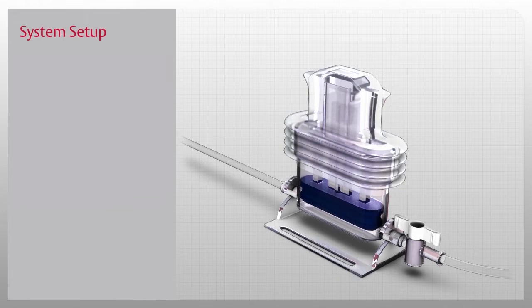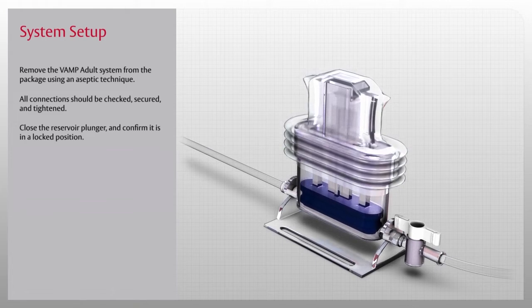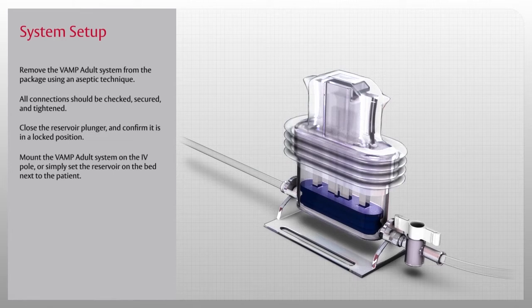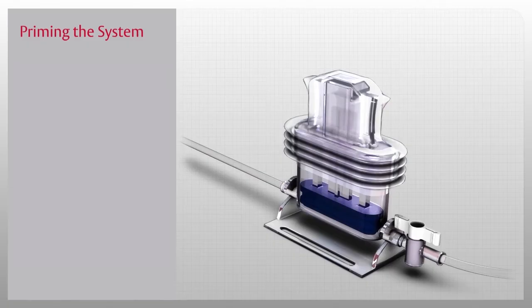Now that you've been introduced to the VAMP Adult System, let's start the in-service by setting it up. Remove the VAMP Adult System from the package using aseptic technique. All connections should be checked, secured, and tightened. Close the reservoir plunger and confirm it is in a locked position. Mount the VAMP Adult System on the IV pole or simply set the reservoir on the bed next to the patient.